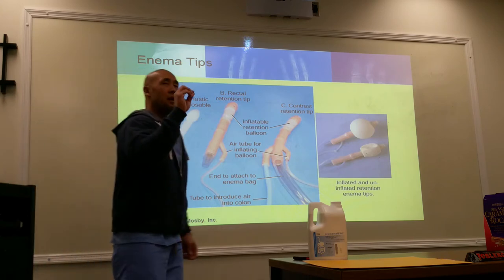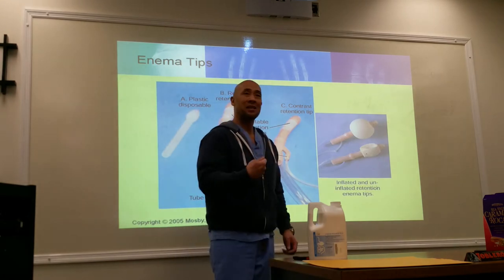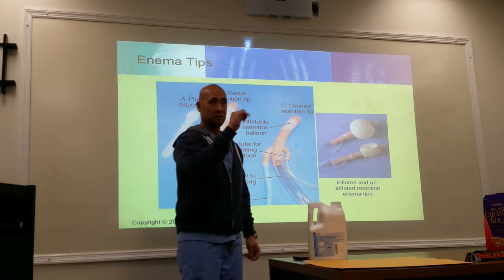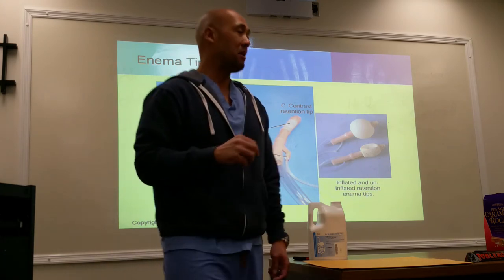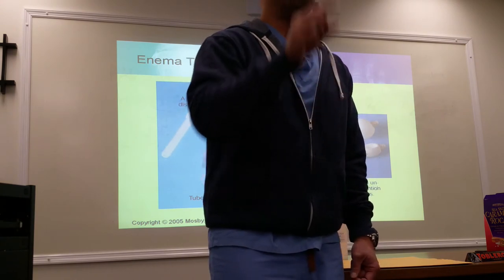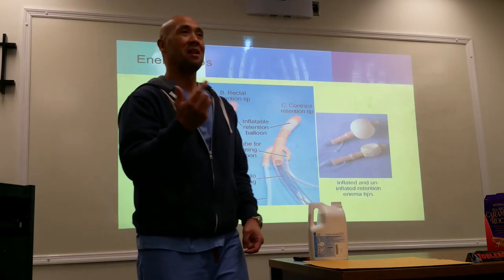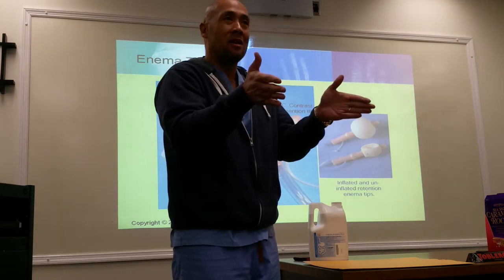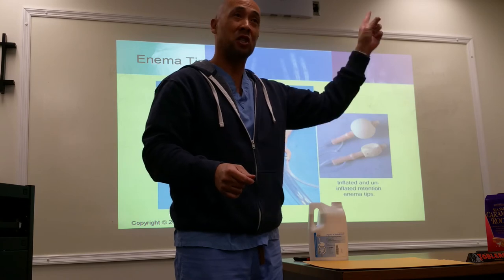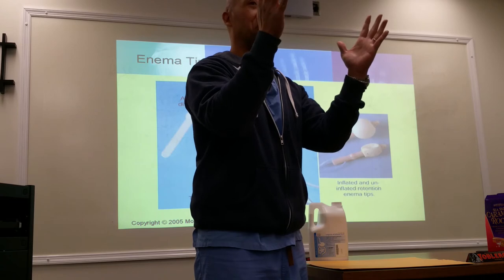The other thing that I want you guys to keep in mind, when you put that tip in and you inflate the balloon, let them know. Naturally, what's going to happen is they're going to want to push, and they're going to feel like they're going to have a bowel movement. Because in your rectal area, there are receptors there that when the fecal material pushes up against the wall, that's when it's saying, oops, I need to go to the bathroom. So now you're putting something artificial up in there, pushing up against the wall. The receptor says, I need to push.